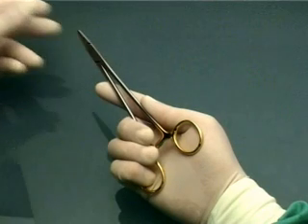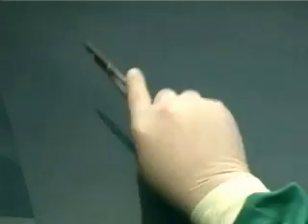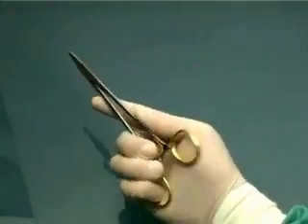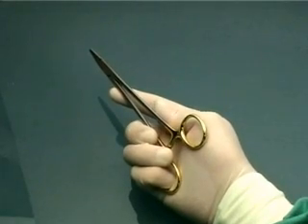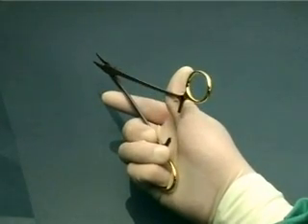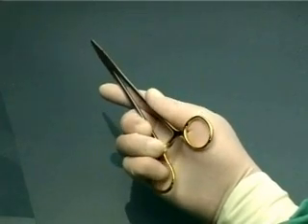The palm grip gives you the greatest mobility, but you may initially find it a bit difficult to disengage the ratchet. It also allows you to rotate the needle holder in your hand so as to reorientate the direction of the needle point. You will see this useful maneuver performed in the section on suturing.